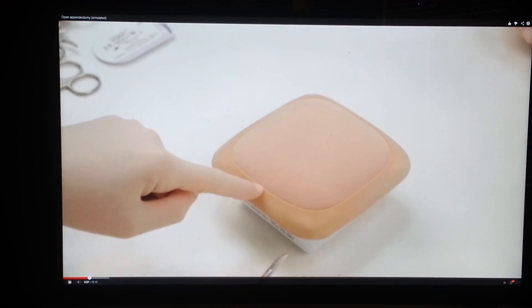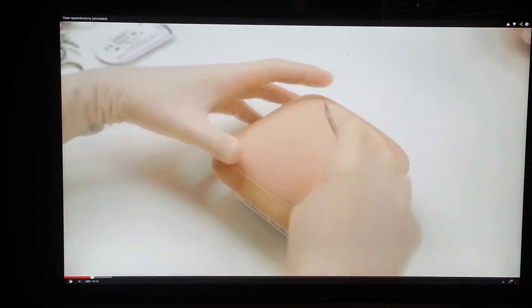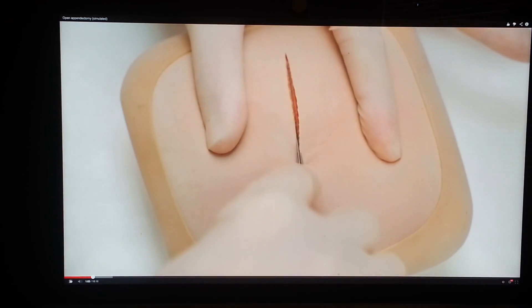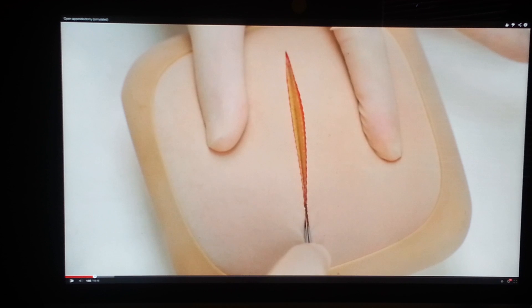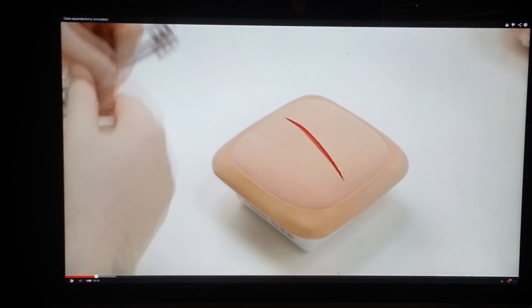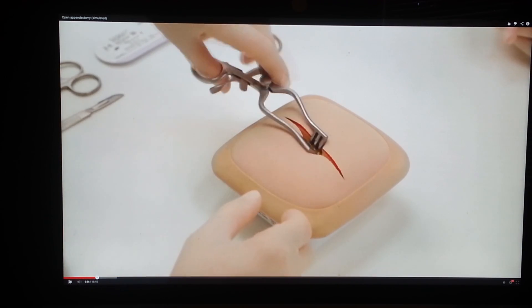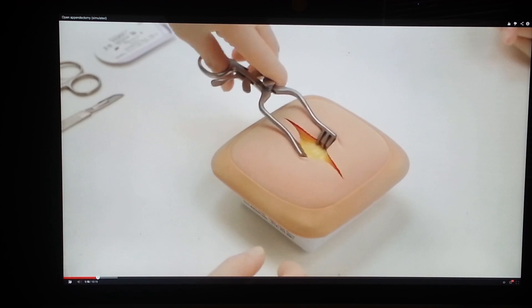In this open appendicectomy model, a Lanz incision is performed. The skin is incised with the belly of the knife. Next, divide subcutaneous fat, Scarpa's fascia and underlying tissue to expose the external oblique aponeurosis.